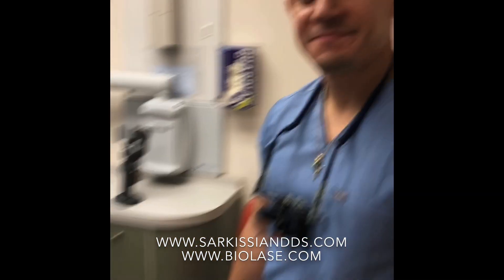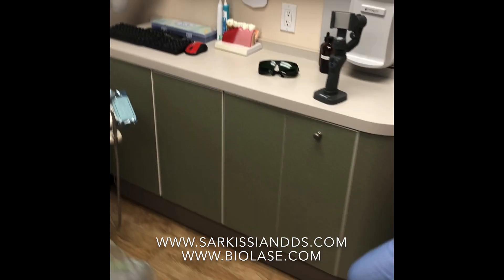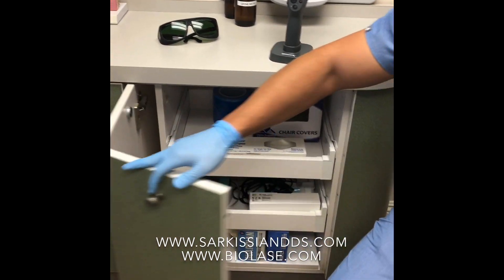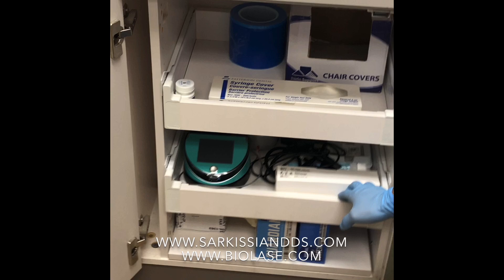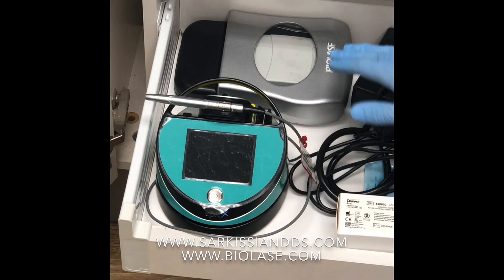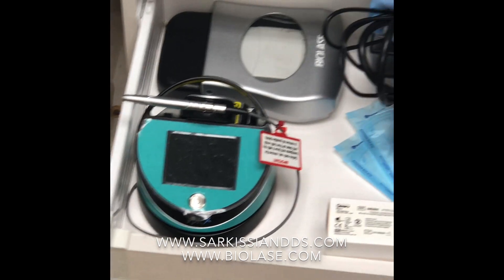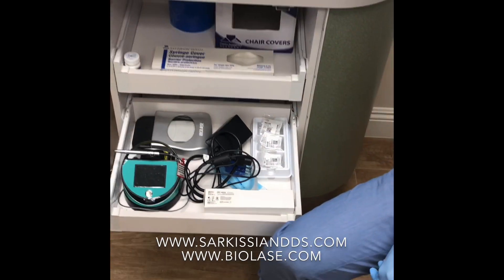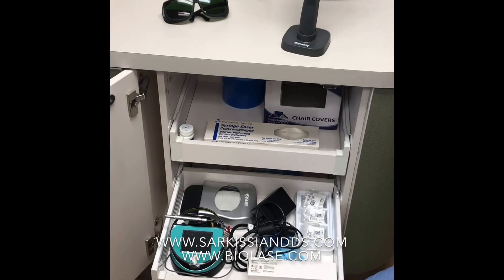This is our hygiene room. We keep our Epic X laser in this cabinet right here in the second drawer, and you'll find everything that pertains to the laser in here: the unit itself, the foot pedal, the power cord, and the tips. We're going to go through setting all of these up and using this device.